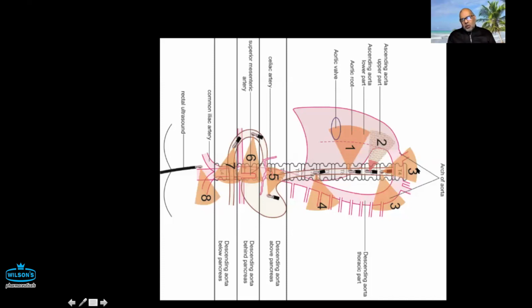So if you put a scope here, actually, the esophagus is posterior. And if it is facing posteriorly, or if it is facing anteriorly, now you can see what the images describe or what the movies describe or what the books describe. Now, if the scope is facing anteriorly and the patient is in the left lateral position, if you rotate the scope clockwise, the scope is going to look from this side, and it's going to move like this side, all right?